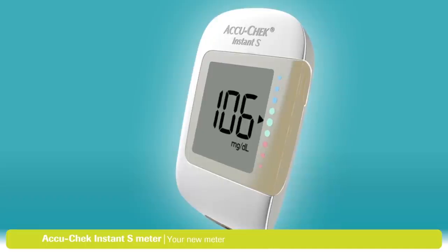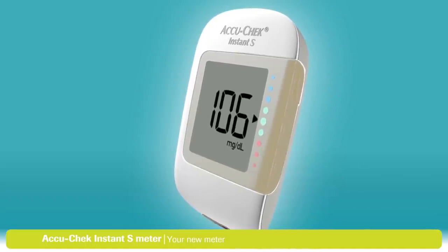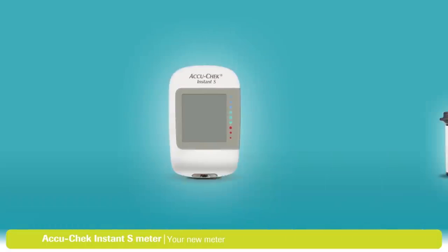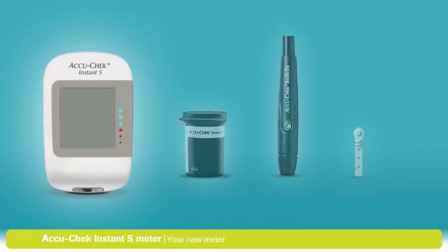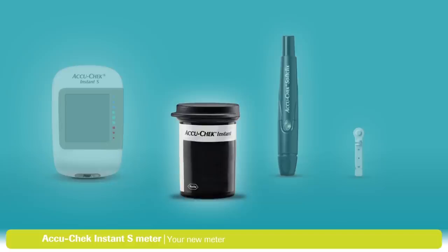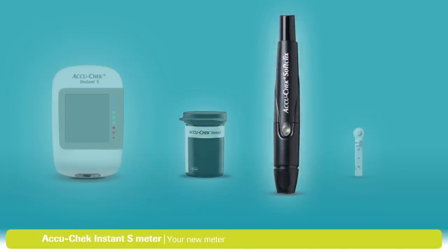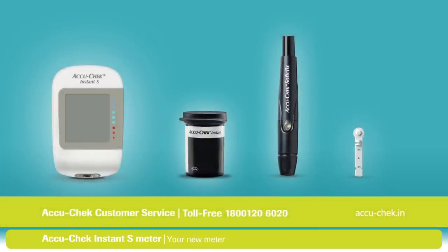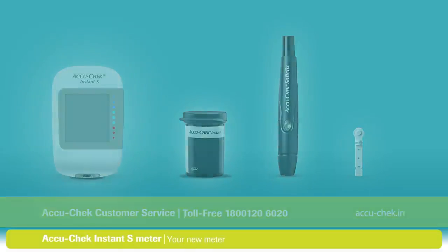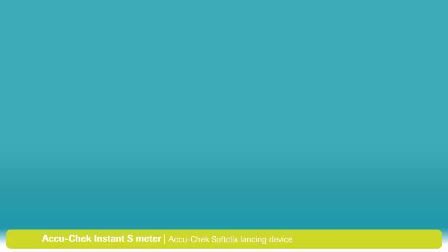The first thing to do is to make sure that you have everything you need to start testing. You should have the following items: an AccuCheck Instant S meter, a container of AccuCheck Instant Test Strips, an AccuCheck SoftClicks lancing device, and an AccuCheck SoftClicks lancet. If you can't find something, or if you need assistance with any of the steps that follow, just contact the AccuCheck customer service.